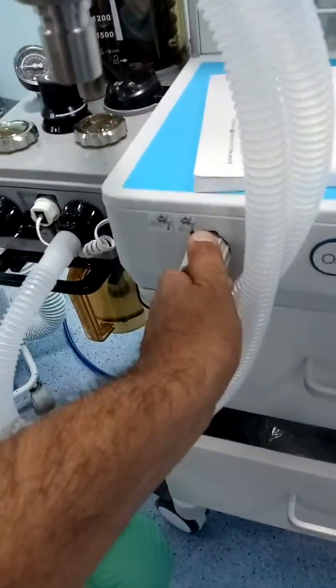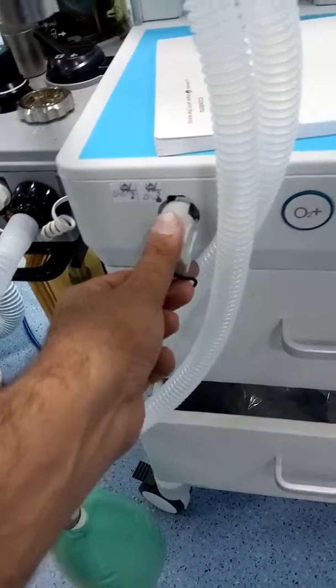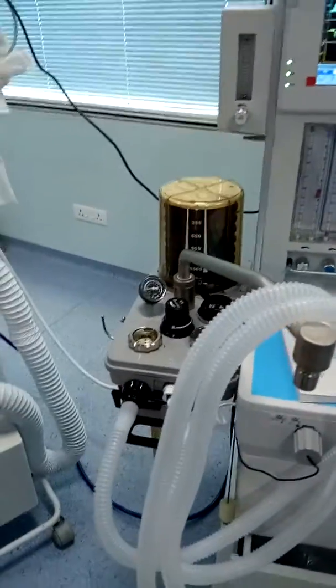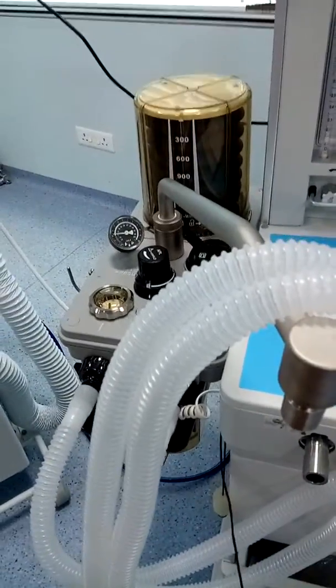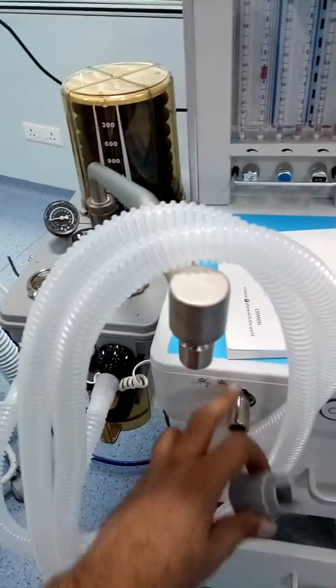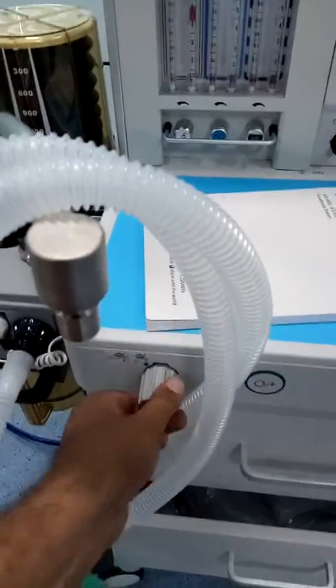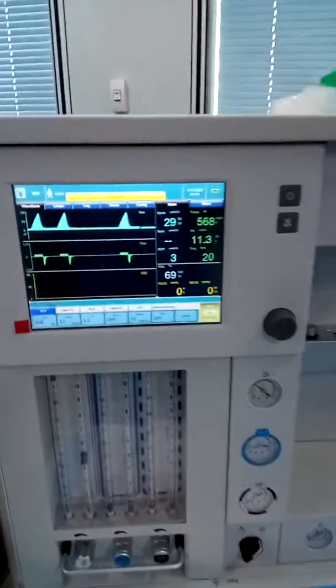The machine is working now — I'm just showing you. This is the main circuit port. Now you can see the ventilator has started. If I open this, the ventilator will stop working. Now the ventilator is not working because the entire fresh gas is coming from here. Now you can see the alarm — let's look at what the alarm is.